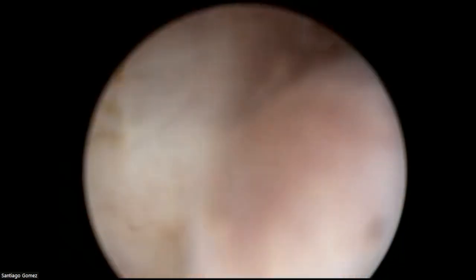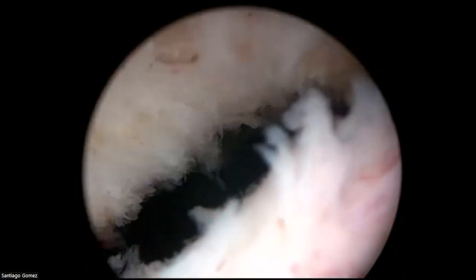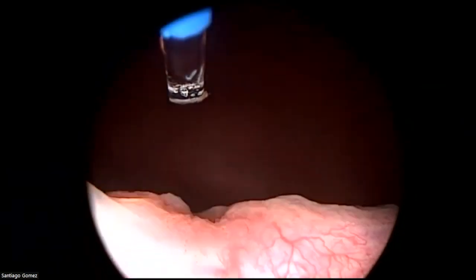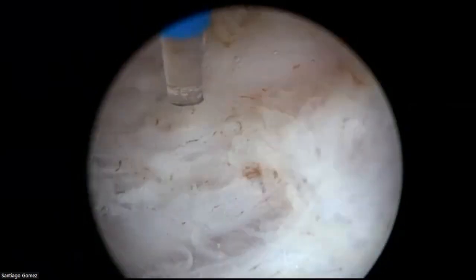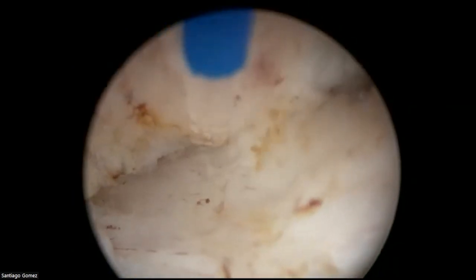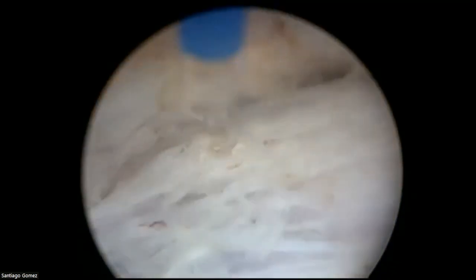Of course, as the prostates get bulkier, sometimes this is the edge I want to cut. And let's see if I can see where the UO is here nearby. It is there, you see, that's the edge of my dissection. So we are now quite certain that we are not damaging the UO.